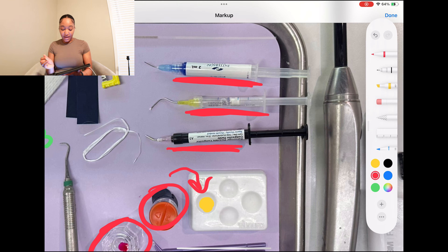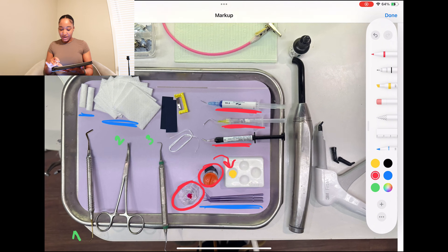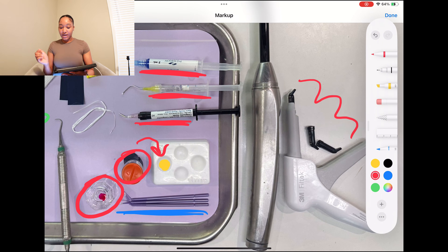A big player in this process is going to be your etch. Etch is always blue — you just know etch when you see it. Etch is placed on the tooth to pretty much roughen up the surface so when you place the bond it's going to adhere the packable and flowable better. It takes off just a little bit of the enamel surface to rough it up and start the process. Over to my side here, this is my packable composite. The gun is already loaded with one and I have two extras.